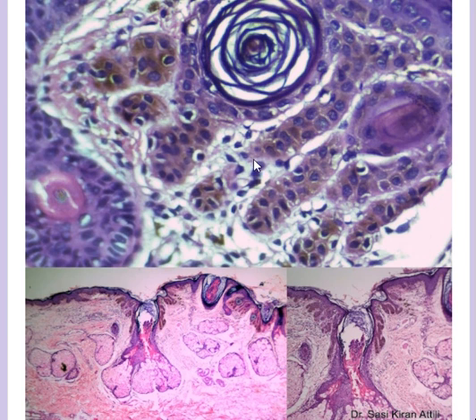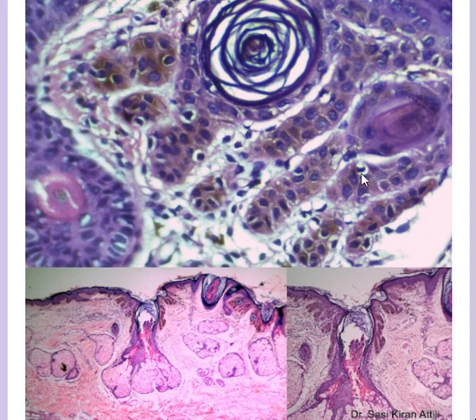You can see that these are elongated rete ridges, and you can appreciate the branching here. The number of melanocytes is actually the same - these are the melanocytes, which are the vacuolated cells in the basal layer. The melanocyte-to-keratinocyte ratio in the basal layer is usually 1 to 8.